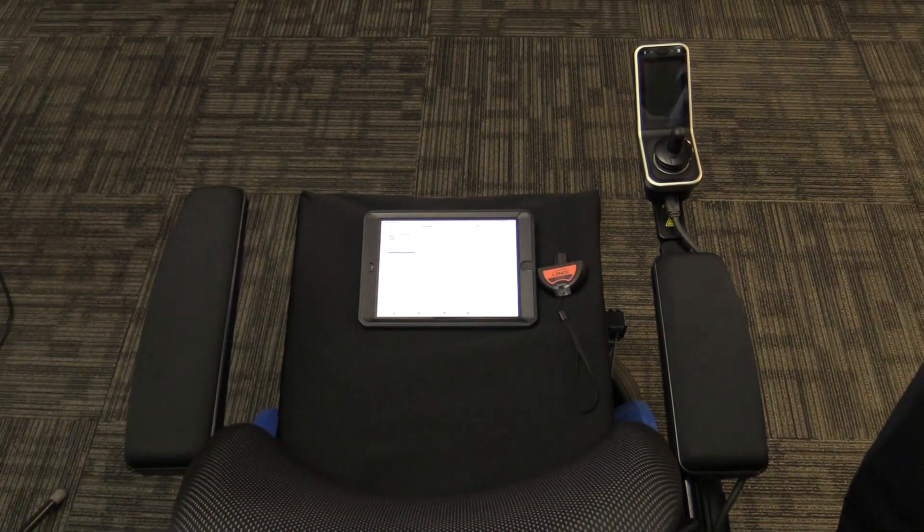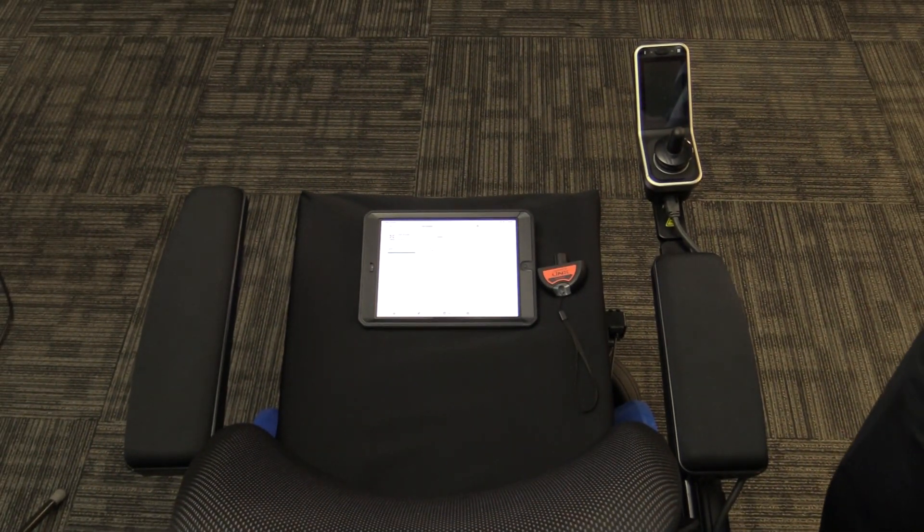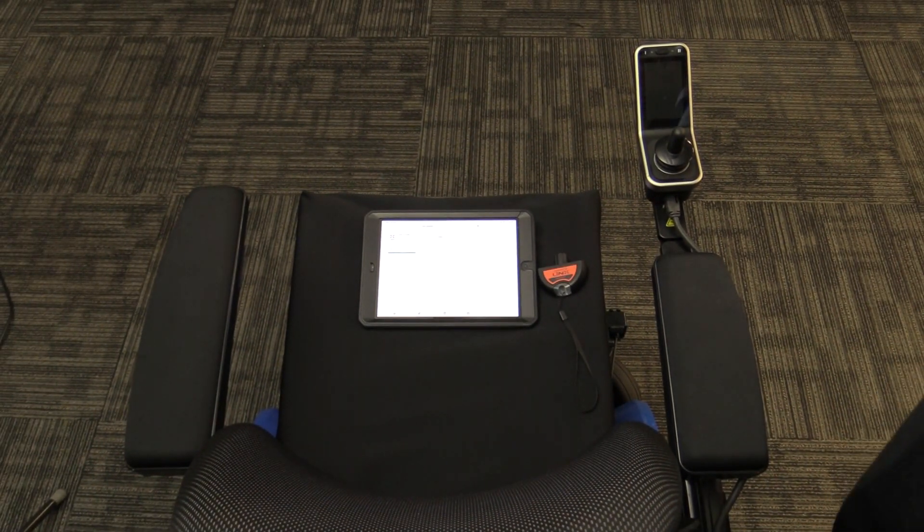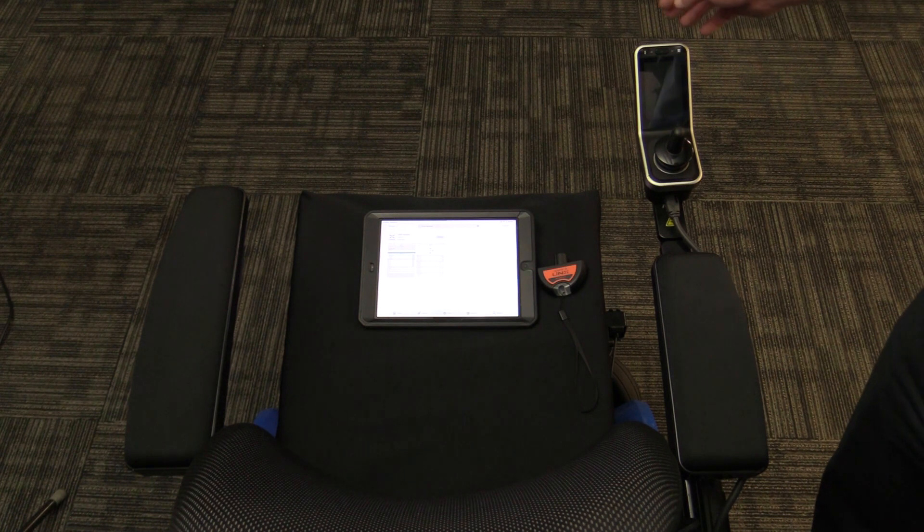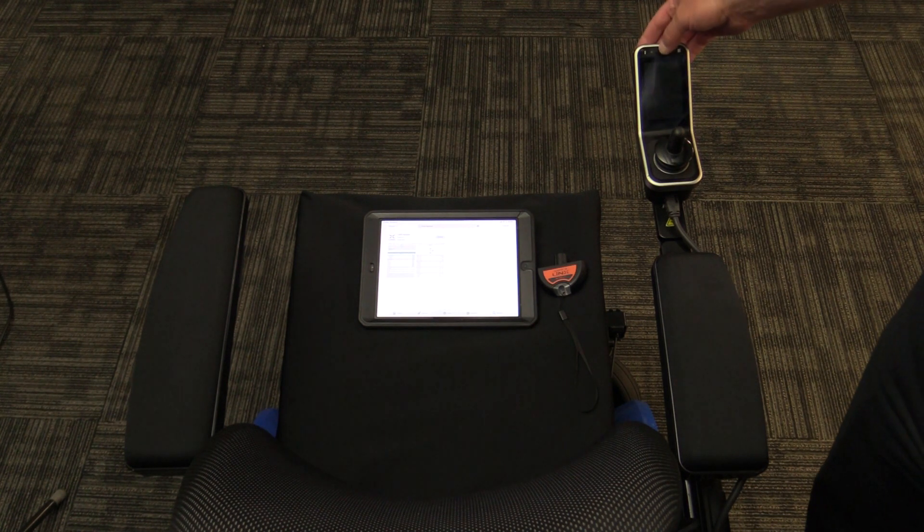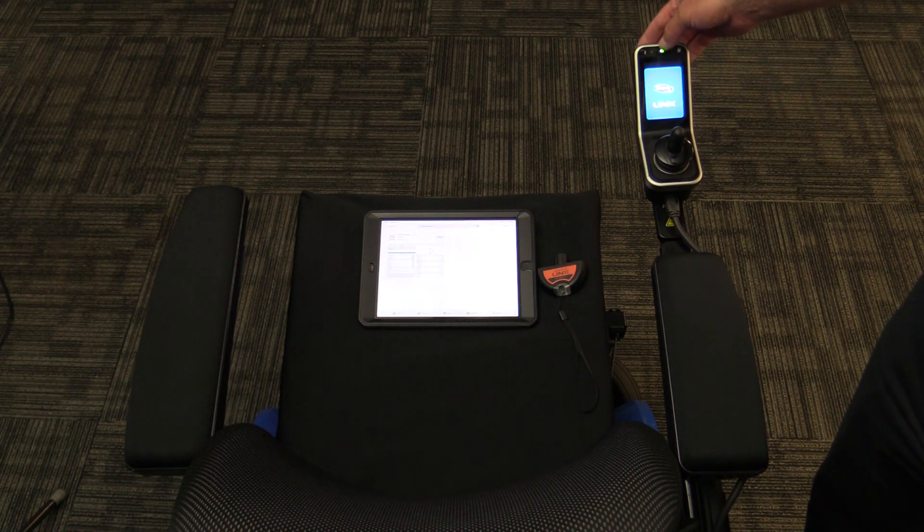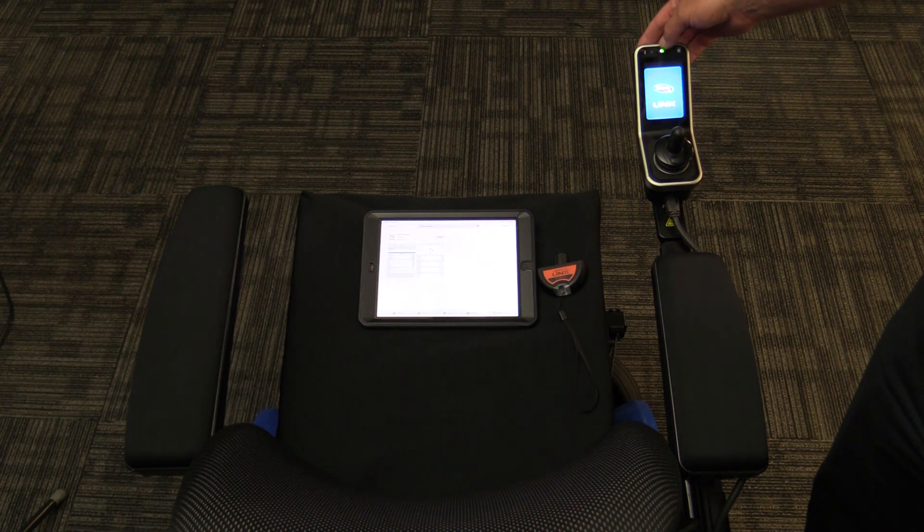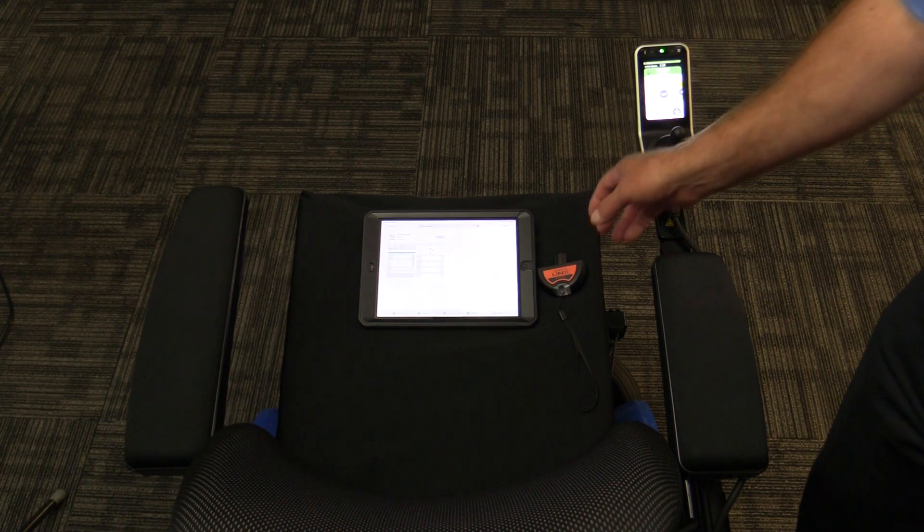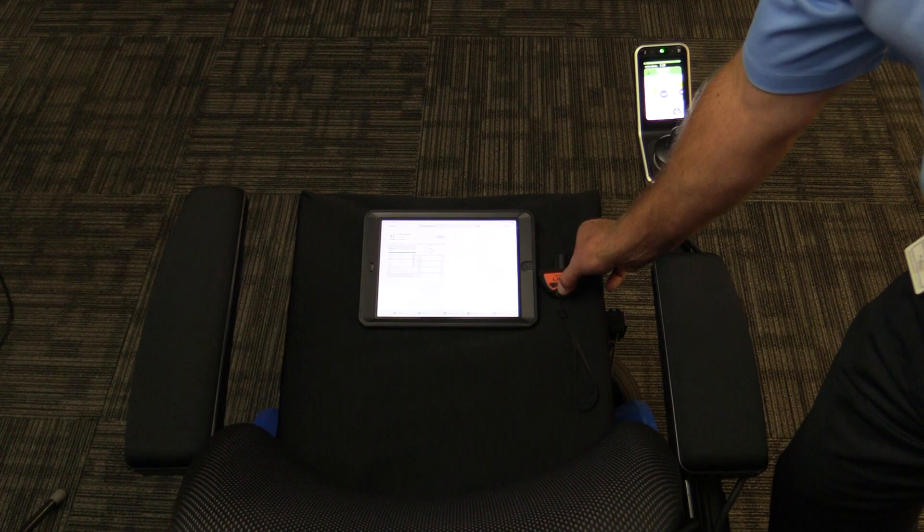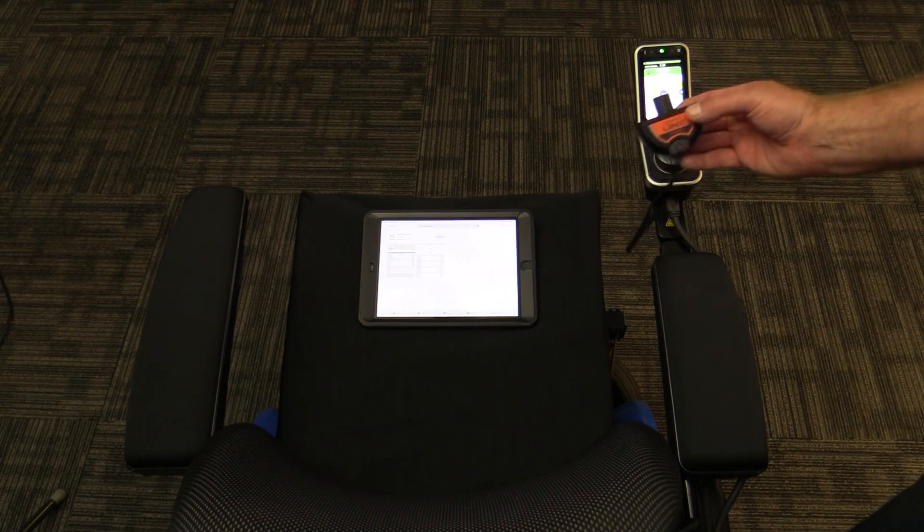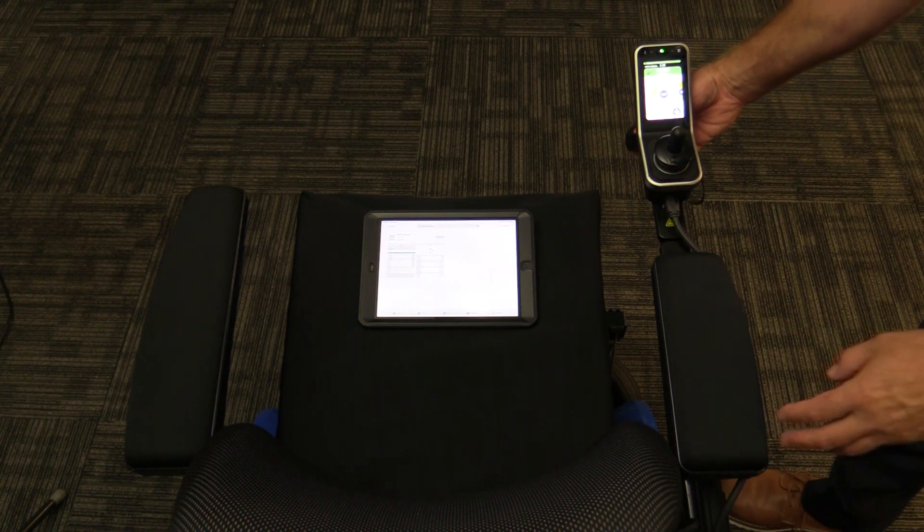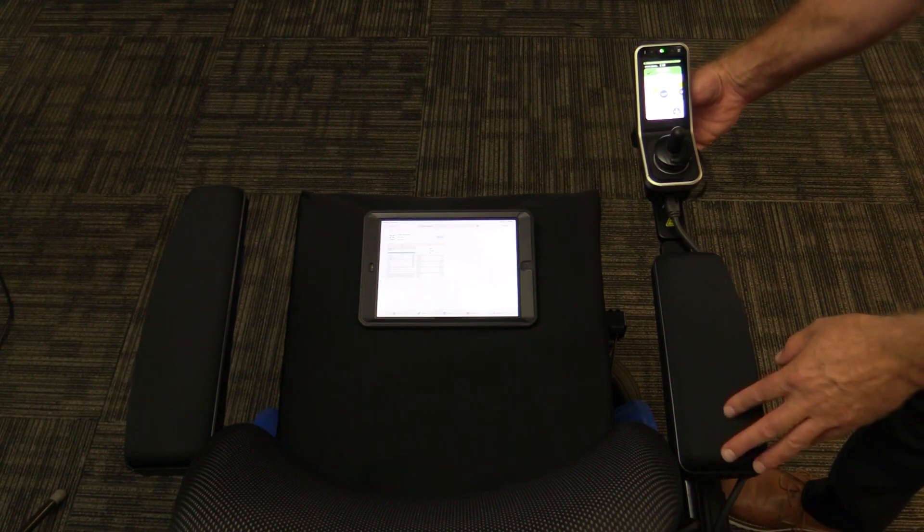After the Lynx Access app has installed, we are going to turn on the chair, and we are going to insert the LAC into the charger port in front of the joystick or the display.